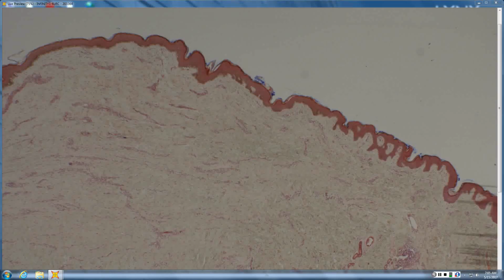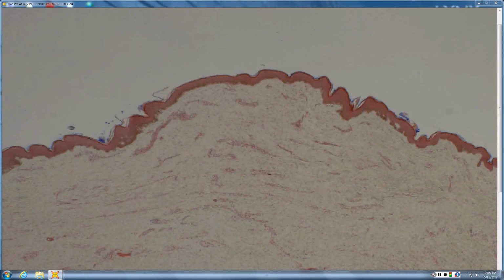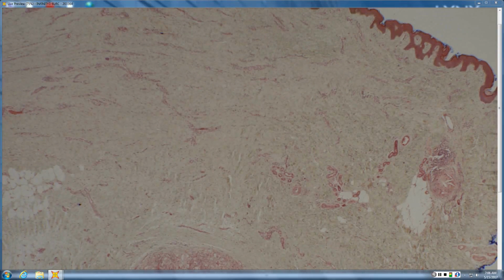And then this one is a suture granuloma. And you can see up top here, this is probably a scar. There's maybe an excision here of some sort. And then deep down here, from scan you might be thinking, is this some infectious thing? Is this some foreign body? Is this something else going on? But it's really just a granuloma, a lot of histiocytes.